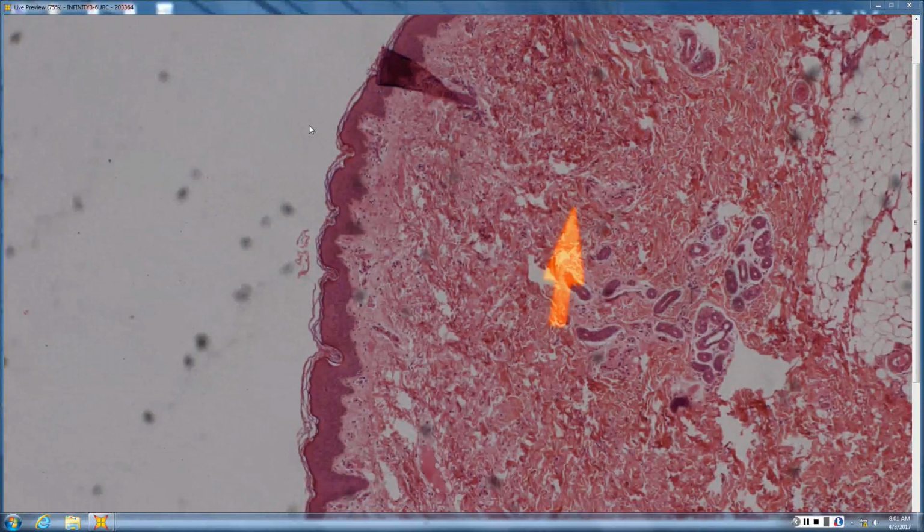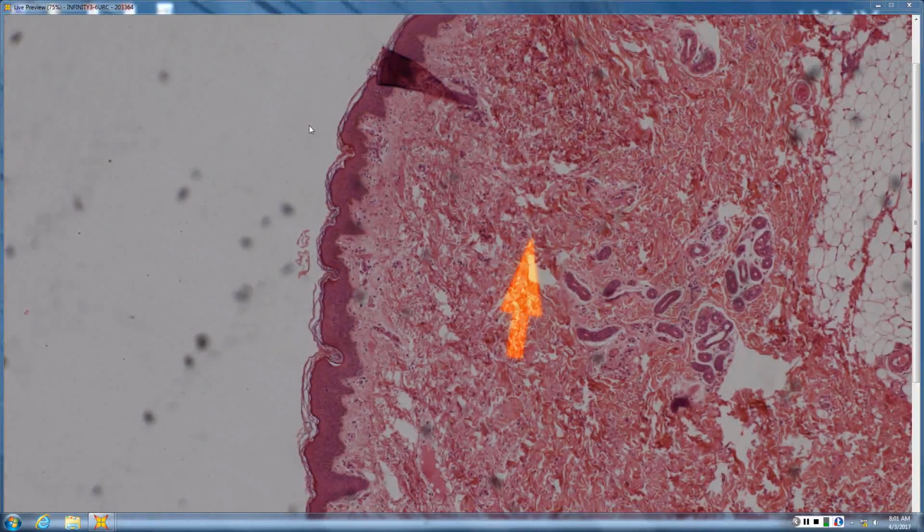Oh, yeah. When you look at it, you can see how red the collagen is and how small those collagen bundles are, so it looks like kid skin. Any kind of big vascular tumor that starts out as solid endothelial cells and then makes little round vessels in babies is just an infantile hemangioma.